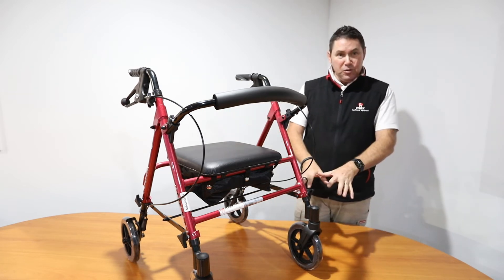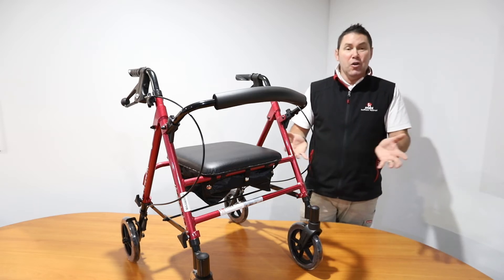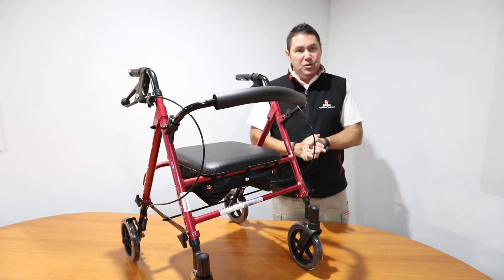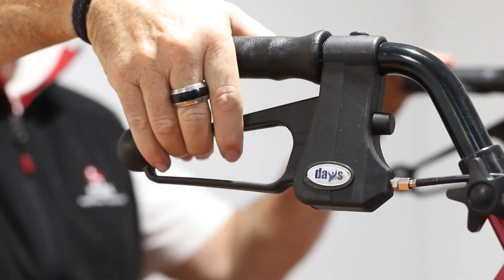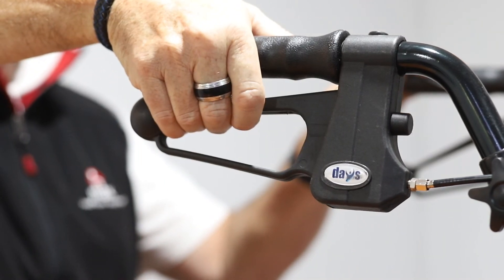The larger wheels on this walker make it really easy to move around the home or even outside. The brakes are simple to use — squeeze up to apply the brakes, and push down to lock the brakes in the on position.